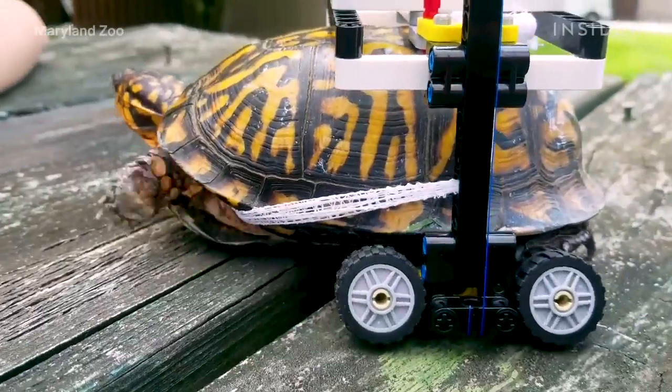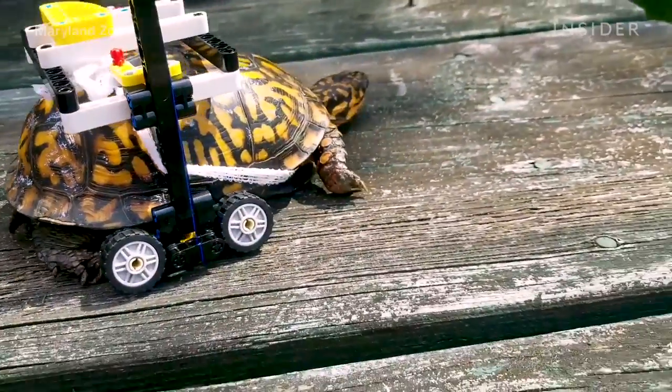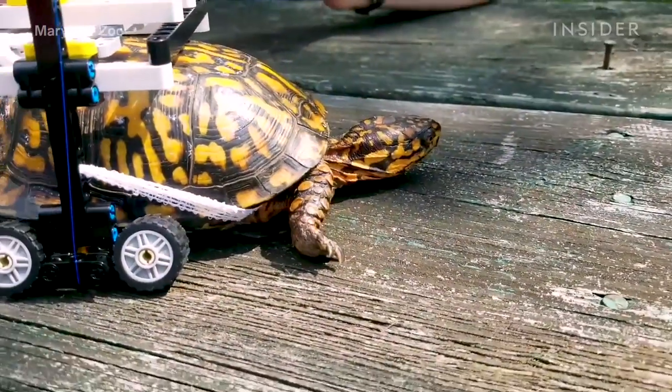I thought he might still be a little limited in movement, but he can turn on a dime and scoot like a normal turtle, so I was really impressed with that. And also at the response of the other staff members here — it wasn't ridiculed for being kind of a zany idea.